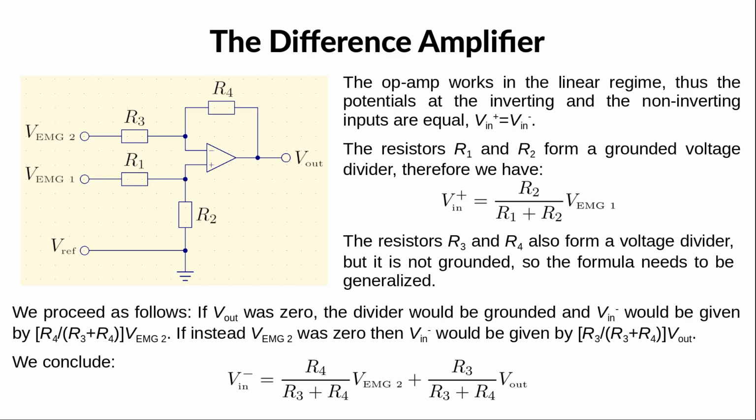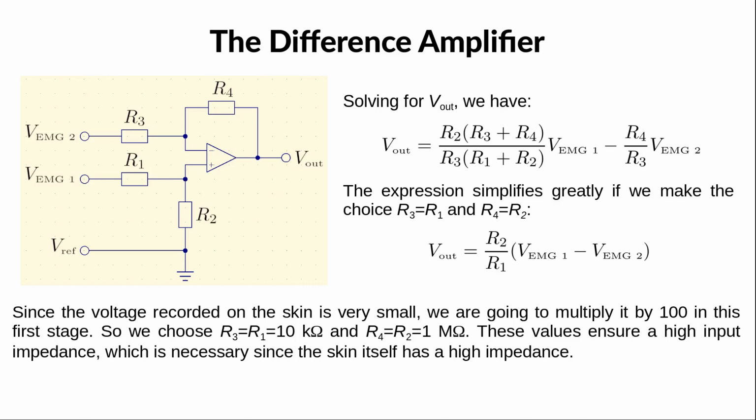Suppose that Vout was 0. Then the divider would be grounded and Vin minus would be given by R4 over R3 plus R4 times VEMG2. If instead it was VEMG2 that was grounded, then Vin minus would be given by R3 over R3 plus R4 times Vout. So, for the general case, we apply the superposition principle by adding the two cases. This is valid because resistors are linear components. Now, as mentioned earlier, the inverting and the non-inverting inputs have the same potentials, so we can solve for Vout and obtain this complicated expression.